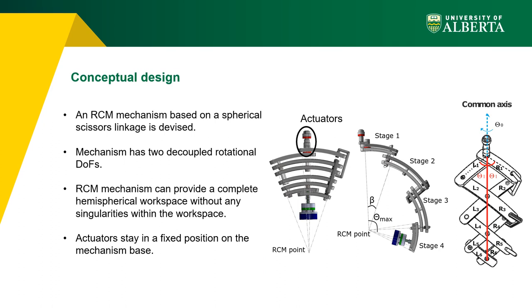To achieve our goals, we adopted a remote center of motion mechanism working based on the concept of spherical scissor linkage. In a spherical mechanism, all device links are curved and are constrained to move on a spherical surface defined by the radius of the link. In this work, the number of links and their arc angles are designed to cover a full hemisphere.